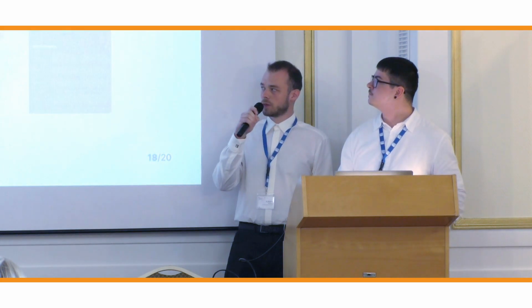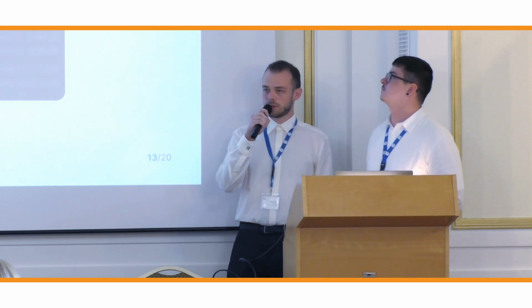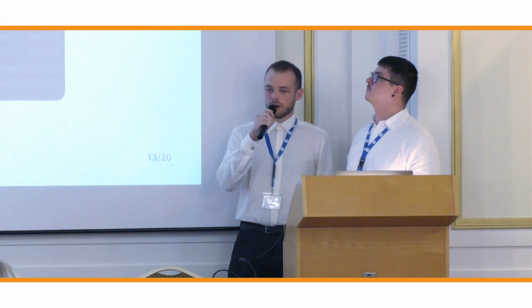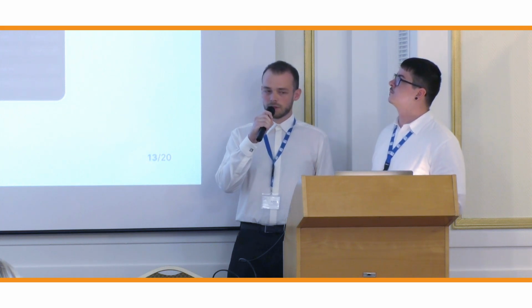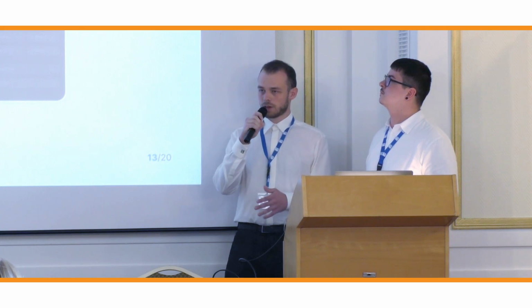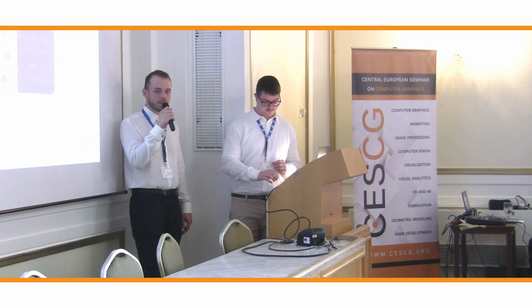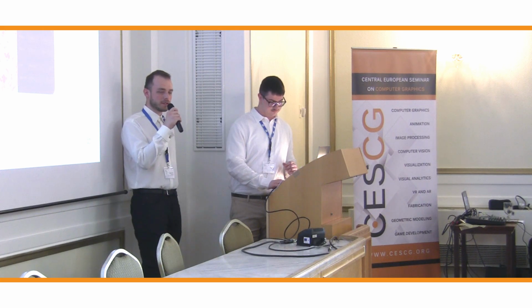Then we send this region to the AI API, and we calculate embeddings, and these embeddings are then saved. Subsequently, the user can use bounding boxes and foreground, background clicks to make annotations, and everything is running on our server.